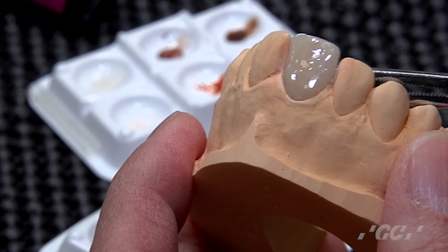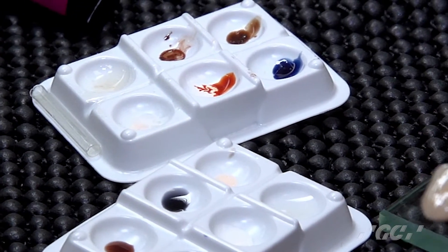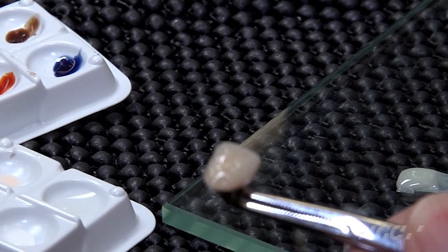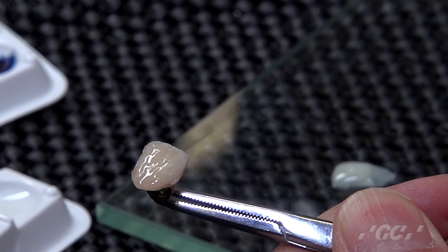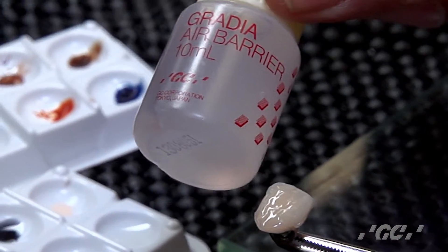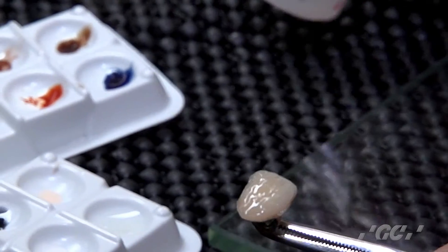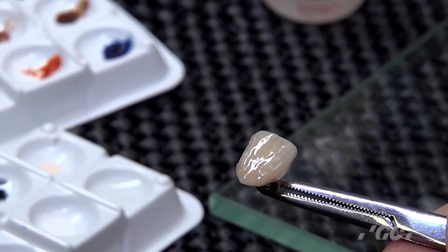Take off the crown from the model. Then fix it around the margins and also the contact area — just a little bit added to it. Then ready for final cure. Before final cure, make sure to use an air barrier and apply it all over. Then final cure — three minutes with GC Lavalite.